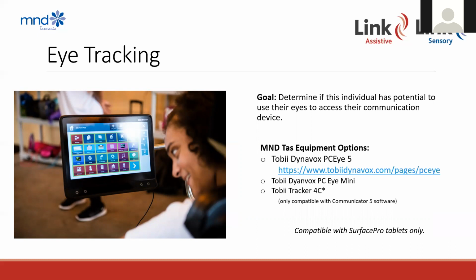Typically, people with motor neuron disease will retain controlled movement of their eyes for a lot longer than they retain controlled movement for the rest of their body. And so that's why this is a really common technology to be used in this population.